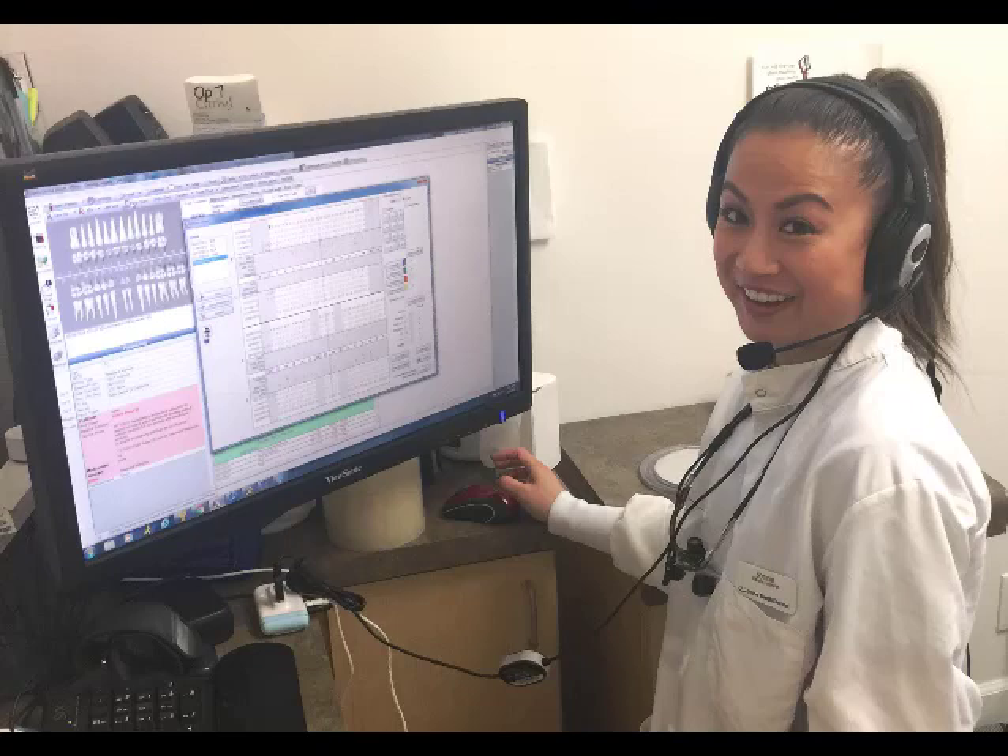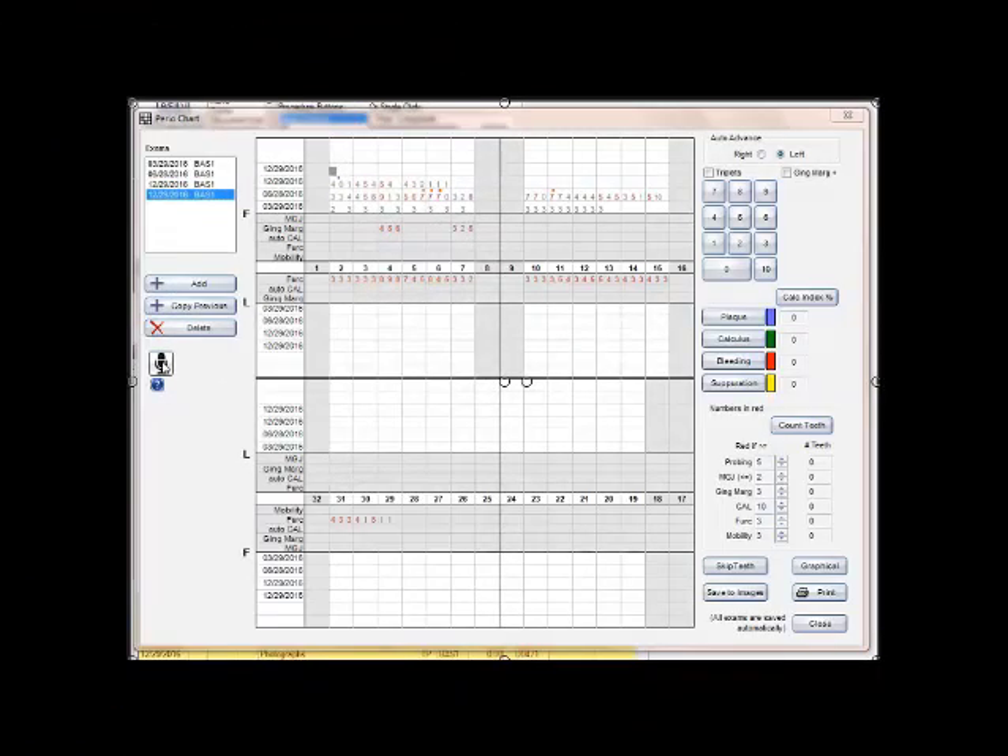The next part of the video is something I recorded previously and have spliced in here. When you call off your entries into the microphone, it echoes back through the earphones so you know that Open Dental understood. When you call in four millimeters, it will echo back four. It also echoes back the tooth numbers automatically. What you're going to hear is the feedback from the software, so you can hear what you have entered. You can't hear both me and the software talking at the same time.